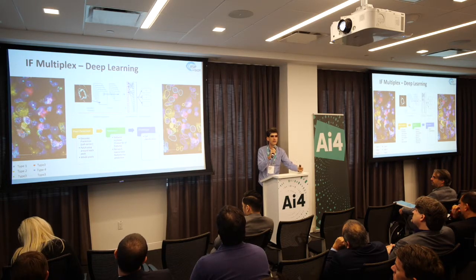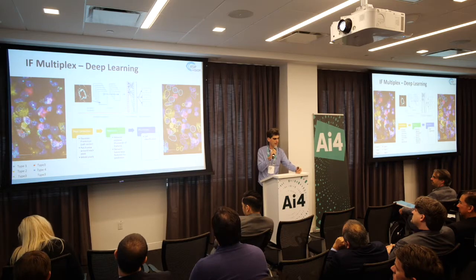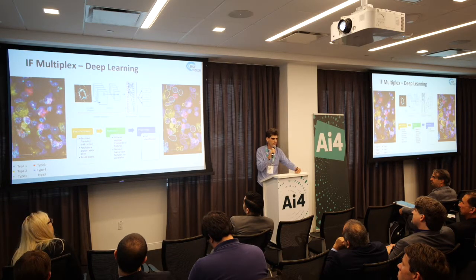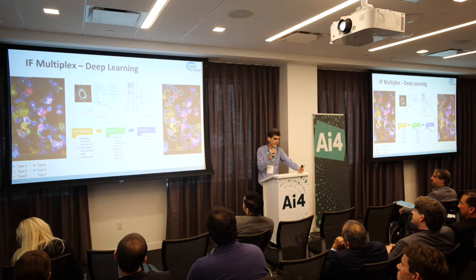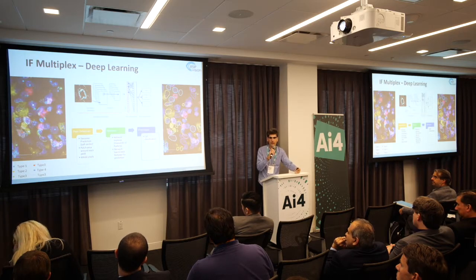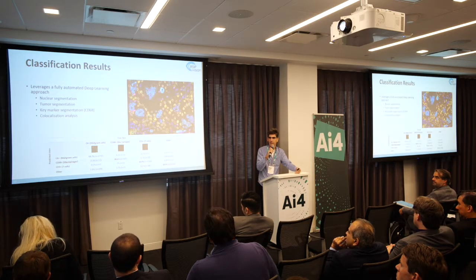So you really need to do this in a deliberate manner. You can't just throw more and more data at the problem. You need to understand what the failures are, and to grow your network's knowledge by training it on the proper selection of examples.